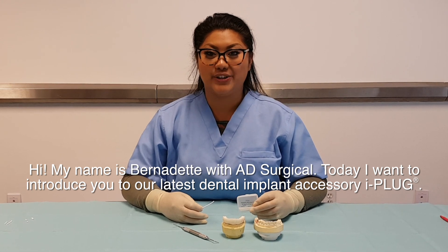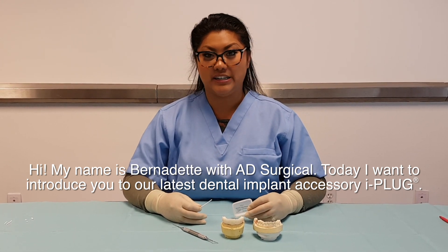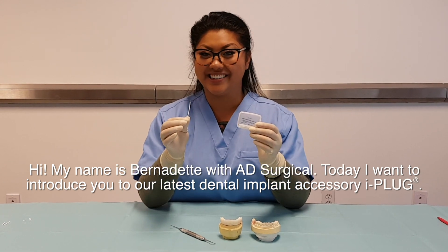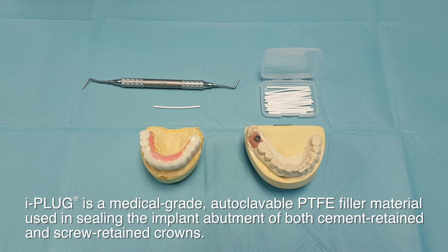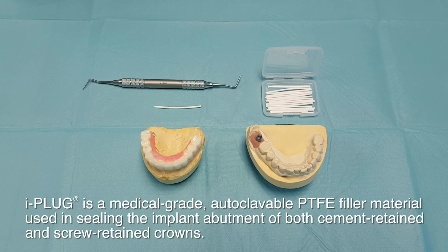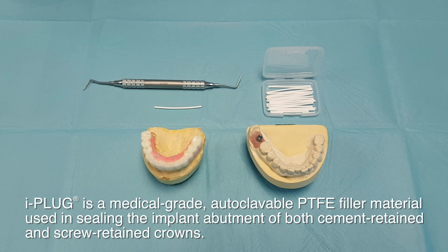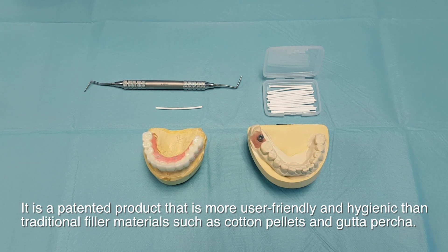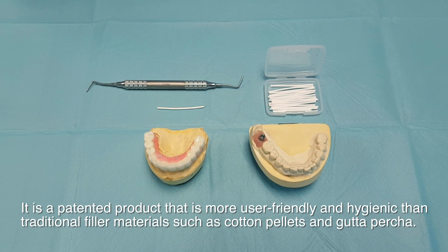Hi, my name is Bernadette with AD Surgical, and today I want to introduce to you our latest dental implant accessory, iPlug. iPlug is a medical grade, autoclavable PTFE filler material used in sealing the implant abutment of both cement-retained and screw-retained crowns. It is a patented product that is more user-friendly and hygienic than traditional filler materials such as cotton pellets and gutta-percha.